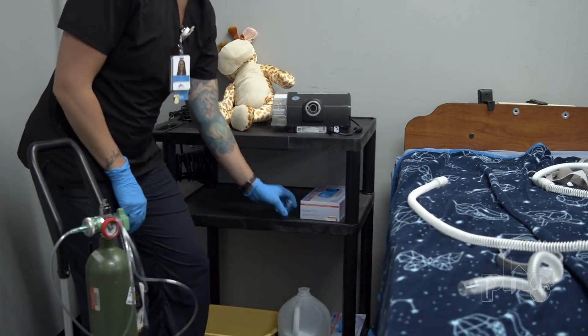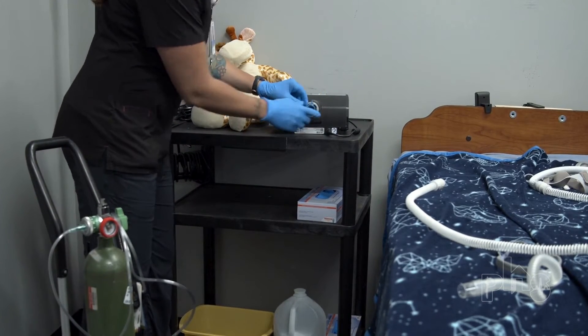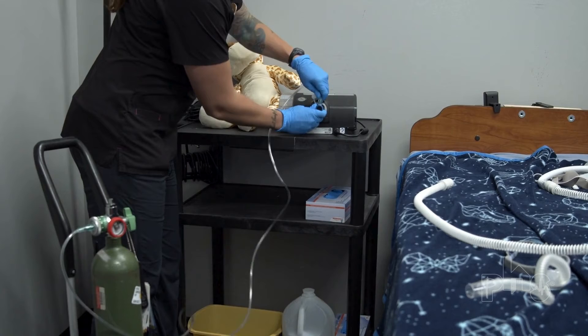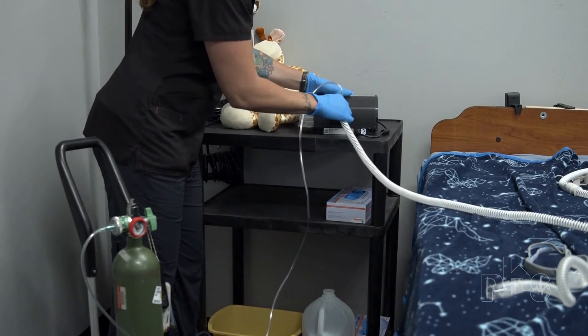If the patient uses oxygen, an adapter is added to the tubing. This adapter allows the oxygen to mix with the air that is flowing to the patient. Some machines require a pressure valve to prevent oxygen from flowing back into the machine, which can cause a fire. The respiratory clinician will set up a pressure valve if needed.